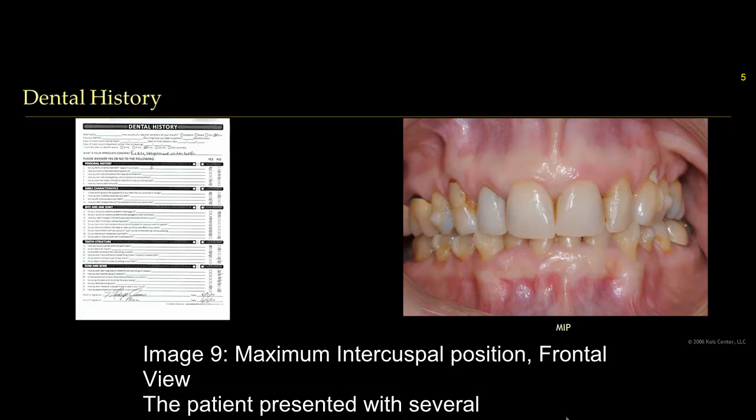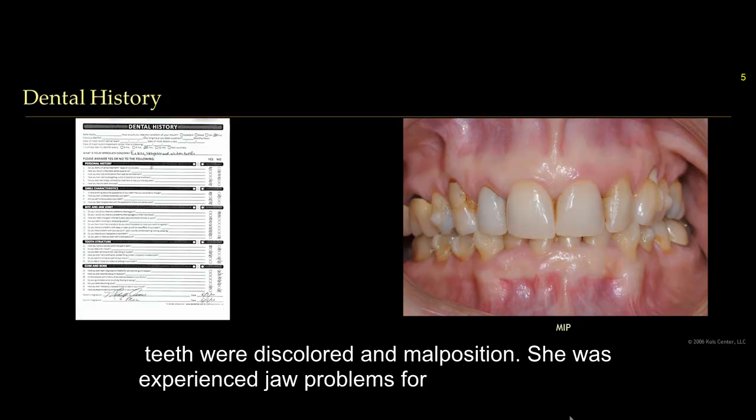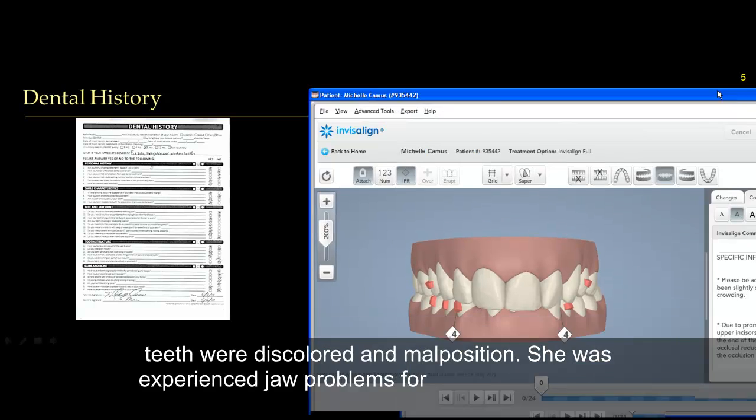She has always been complaining of tension headaches 2-3 times a month with migraine pain, and she had braces in the past, and she used to have an occlusal guard. But looking at the picture right now, you can see that her teeth have been in malposition. She has a deep bite. You see the picture on the screen right now. It's after the Invisalign, but let me show you how she came to me.